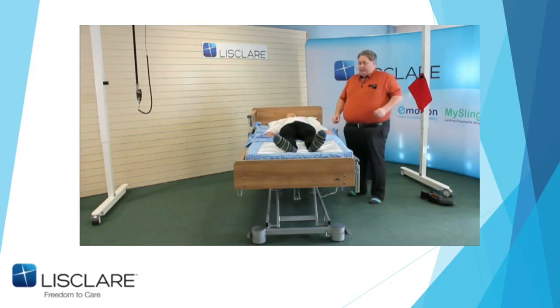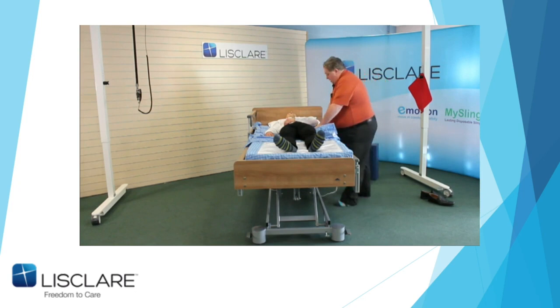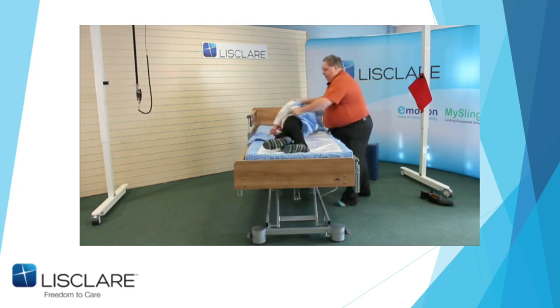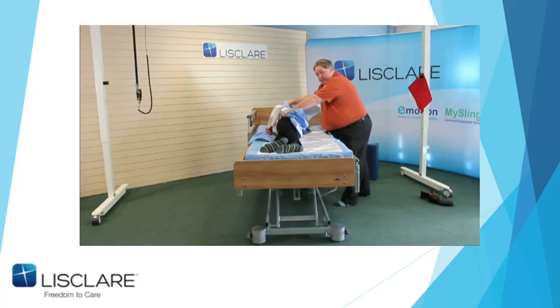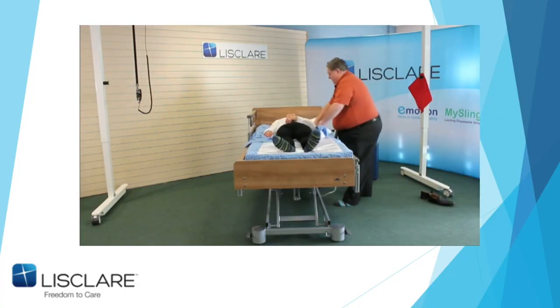What I don't like seeing, believe it or not, is the exuberance of carers, which is the first problem. Because when you've got an in-bed system, this, if there's any manual handling people watching, is an example of how not to do it. They come over to the system, they don't lift the bed up to a nice working height, and the first thing they do is go, oh, this is great, that's easy, without telling the client what they're going to do, which scares the life out of the poor person. Sorry, John. You're used to me now.